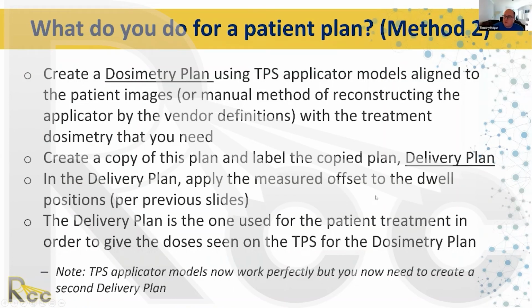Hey, Adam, it looks like we have a question from Ben. Sure. Yeah, hey Adam, between the first method and the second method, is there one that you would recommend? I've gone back and forth between those, and I've discussed with my colleagues, and they've had different comfort levels. Some of my colleagues have liked to use the applicator library, so they can exactly match to the patient.